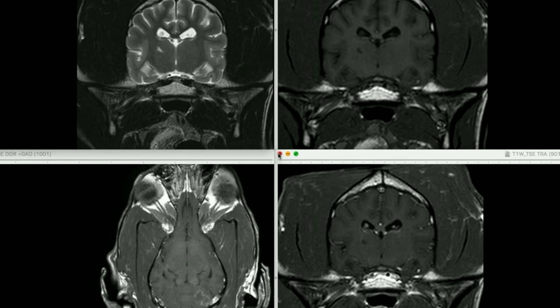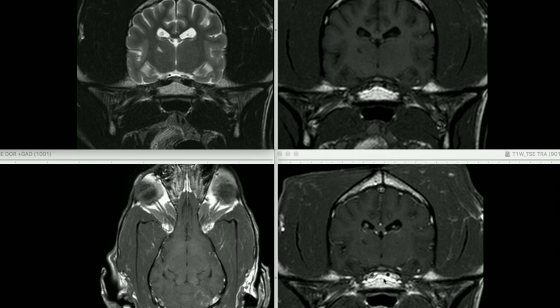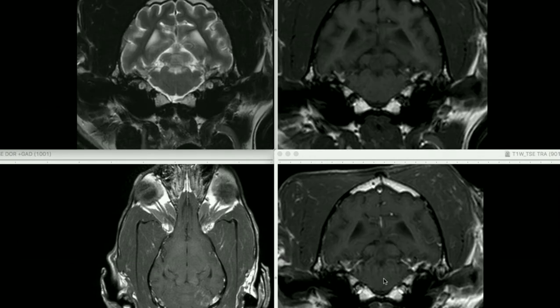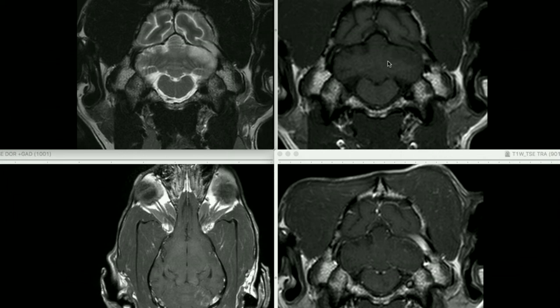Finally, looking at the contrast enhancement pattern — comparing the T1 pre-contrast and transverse and dorsal T1 post-contrast images — the right thalamic lesion shows essentially no contrast enhancement, or certainly very little. Scrolling caudally in the cerebellum, the lesion in the left cerebellar hemisphere shows quite mild, faint peripheral contrast enhancement, whereas there is essentially no enhancement of the lesion in the right cerebellar hemisphere.